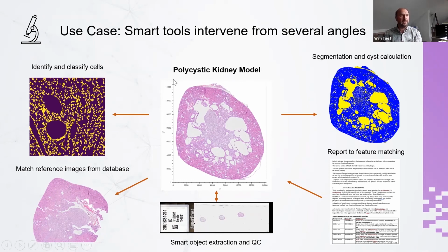And that's one of the, I would say, most hot and attractive items within the current evolution of AI within pathology, is that to better classify and search images would be a major gain in accessing information across the globe.